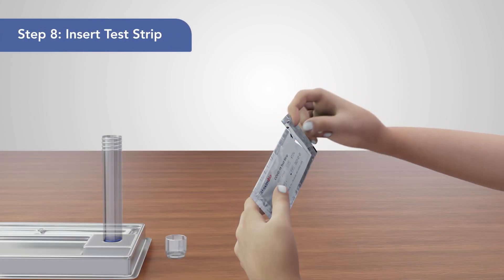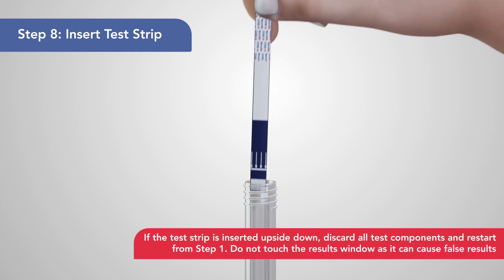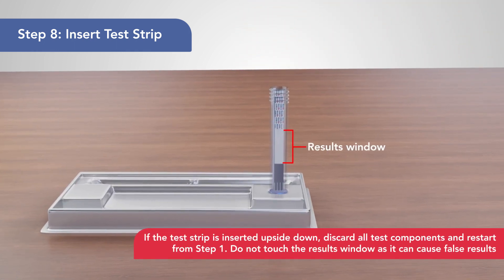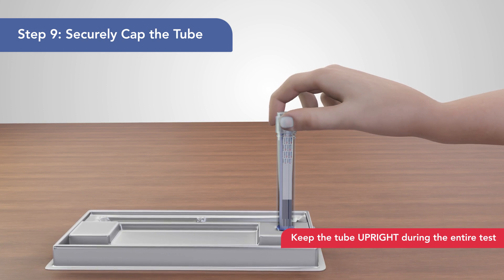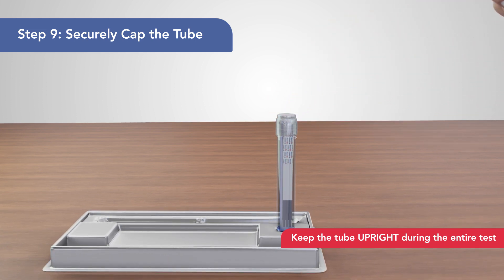8. Tear open the test strip pouch and remove the test strip by holding the MaximBio COVID-19 side and carefully place it into the tube, facing outwards. 9. Keep the tube upright and secure the cap on the tube. Make sure the test strip touches the bottom of the tube.